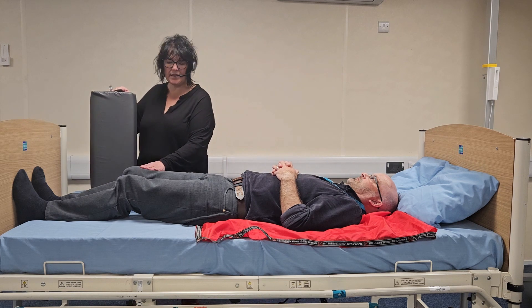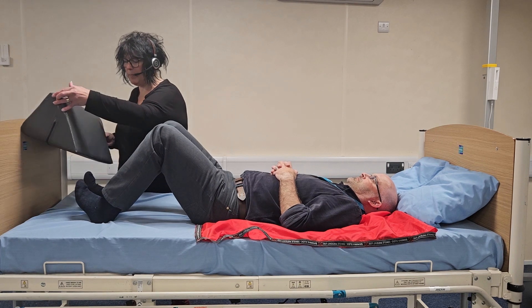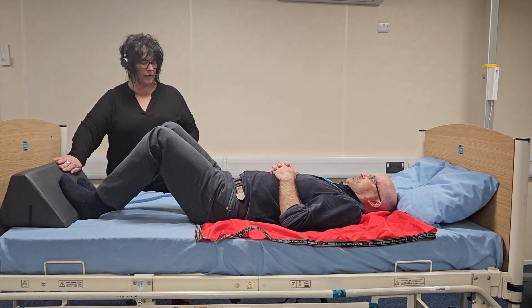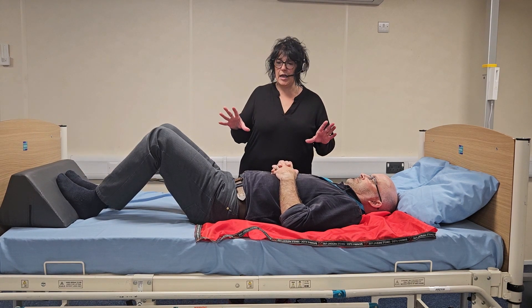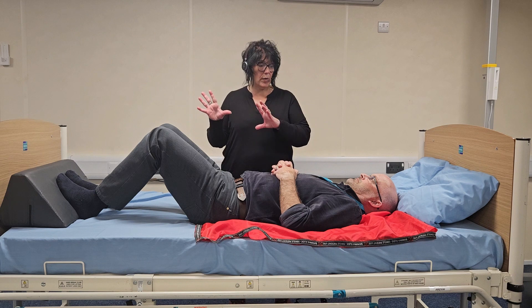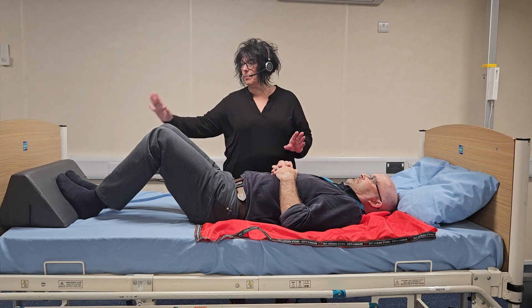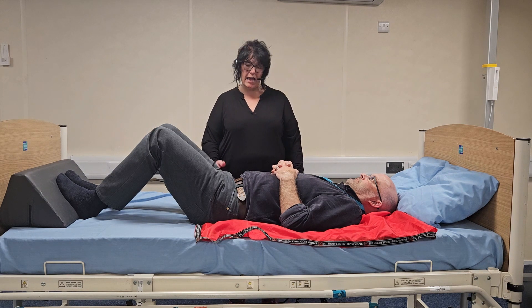I'm now going to ask the person to bend their legs so I can insert the positioning wedge, and then you can pop your feet on there. This is an active technique, so the person is going to do all the work — we've just facilitated it by inserting the wedge and the slide sheets.